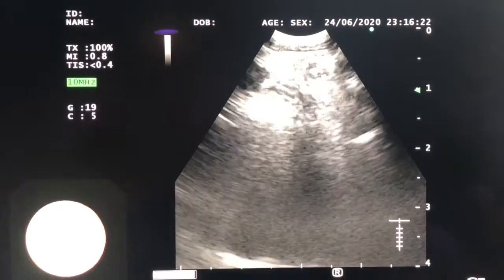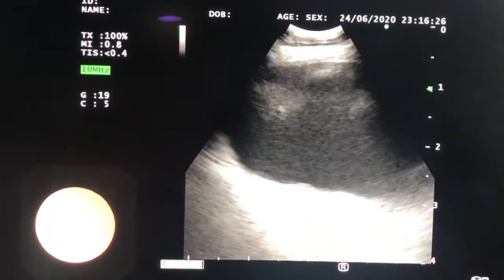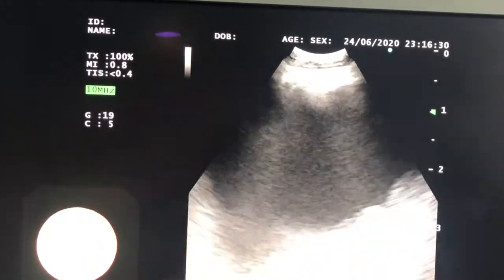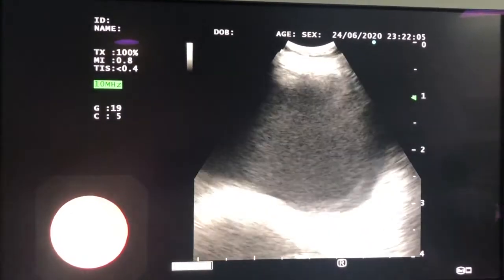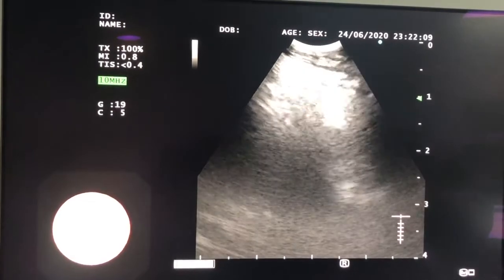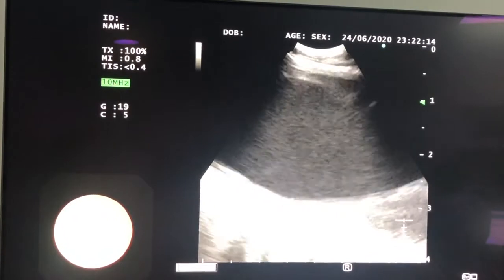I'm pushing the scope down the esophagus until I find the landmark of the left atrium — and there it is. As expected, the large pulsatile chamber of the left atrium is easy to find. Now I'm going to rotate the scope around to the left until I find the descending aorta. There it is.